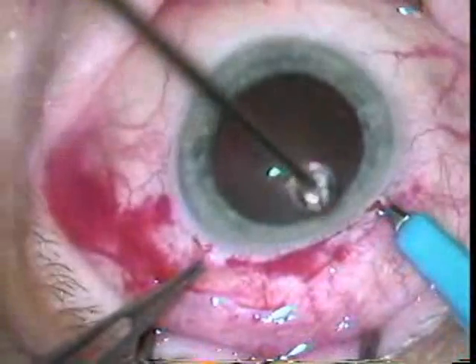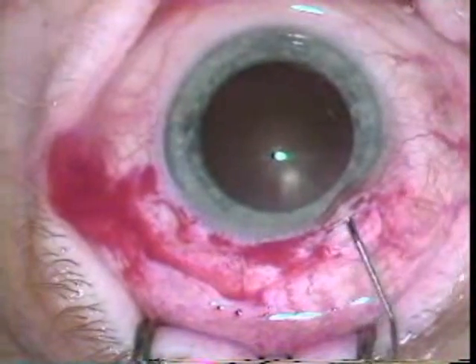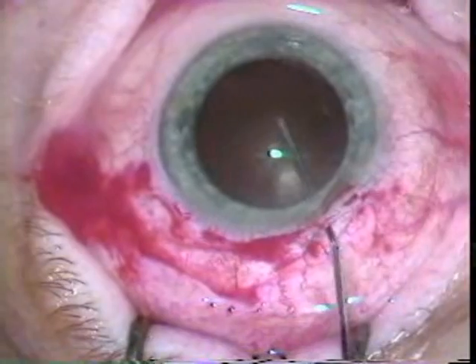The 75 blade is used to make an initial opening into the eye that will allow a can opener capsulotomy. Here you can see he's going all the way across with the cystotome.